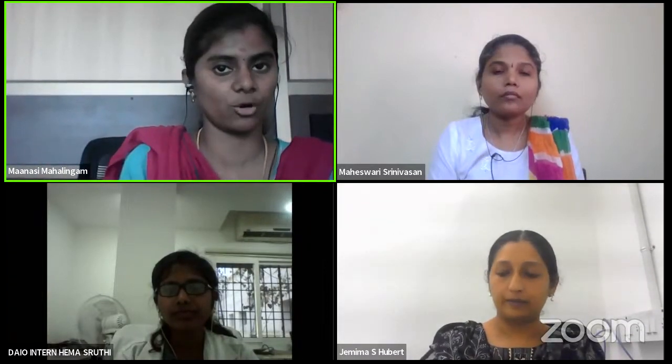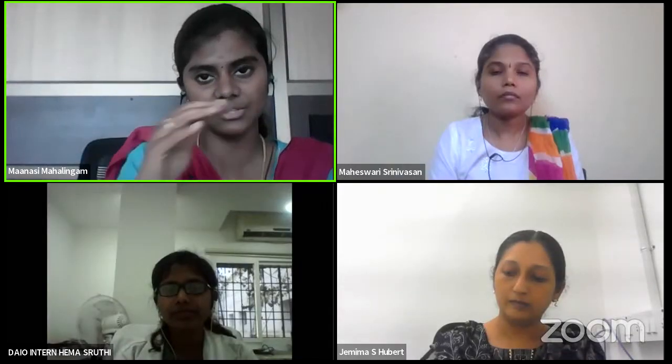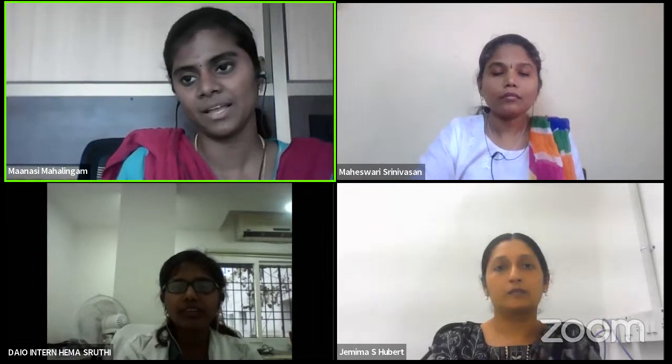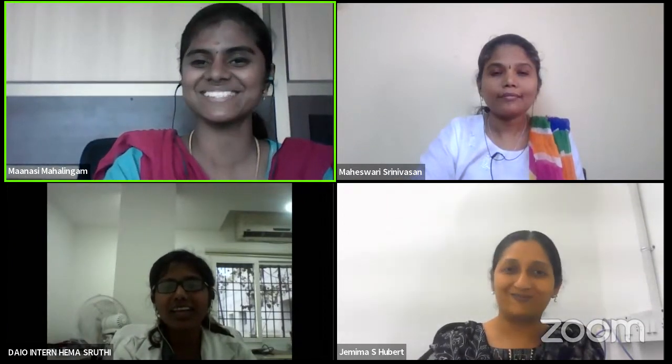So usually it's the dip. If you don't find the dip, it is abnormal. So you can just revise your presentation and see which has an altered foveal contour, and you can list a few findings. And even others can try to answer. I'm asking very basic questions.